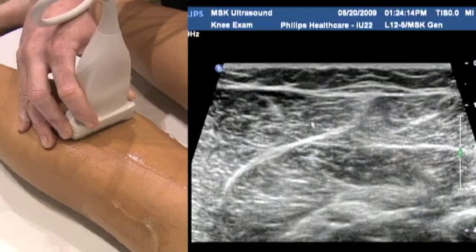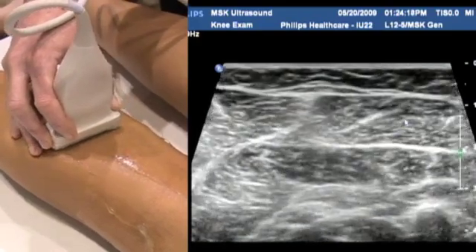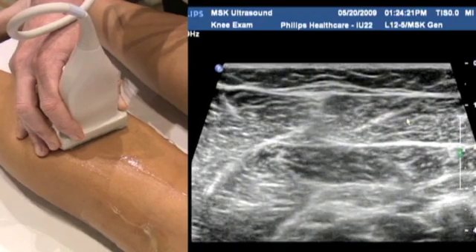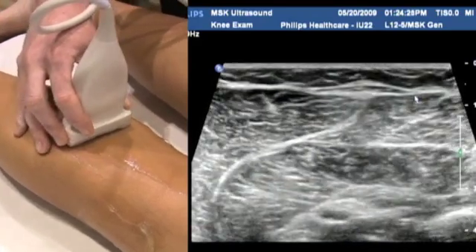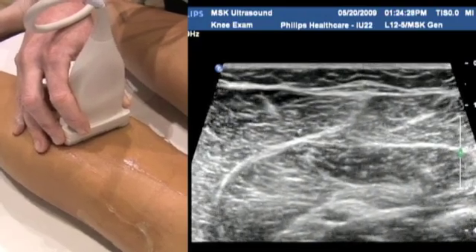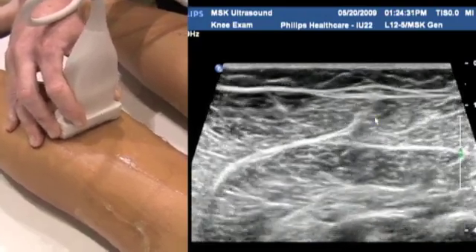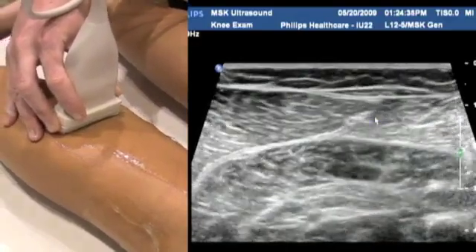Medially, we have the medial gastroc muscle, this big, powerful calf muscle at the back. It has a paired structure on the other side. Again, it should appear about symmetrical. This is the lateral gastrocnemius muscle, and then the soleus underneath. So that's a trio of muscles at the back there, just to be familiar with. Again, just scanning through, making sure everything looks homogeneous.